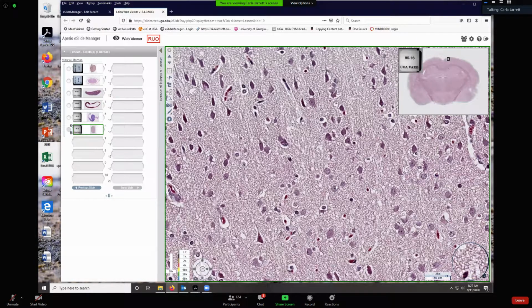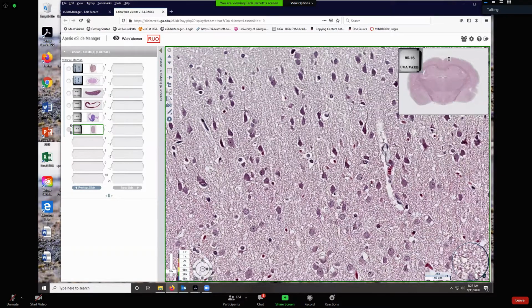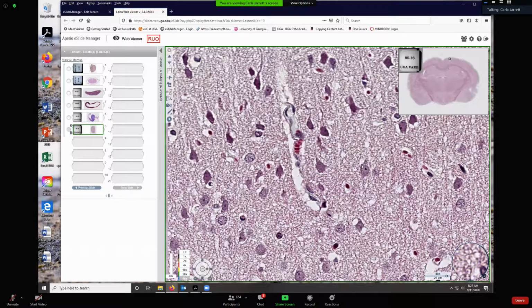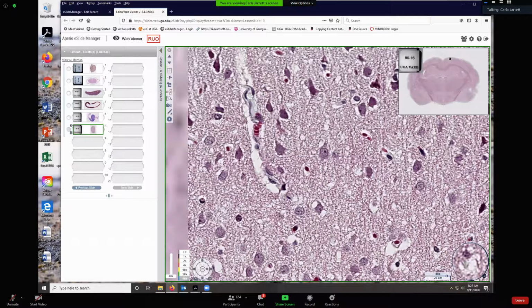That's its nucleolus. I can't see much of its cytoplasm. It's just disappearing in this background neuropile that we've got right here. And that's not uncommon in the central nervous system. Sometimes you'll see some of the cytoplasm, like right here with this round neuron, and sometimes you won't, like here, we just see the nucleus, okay?